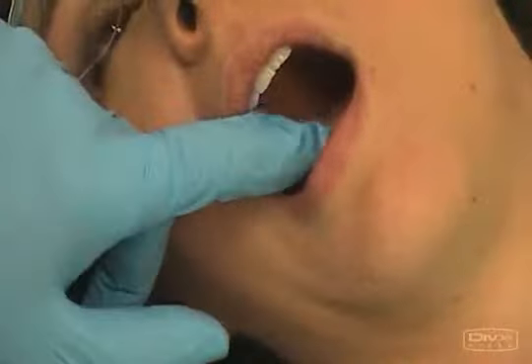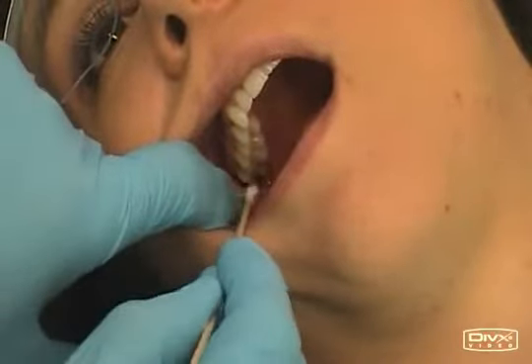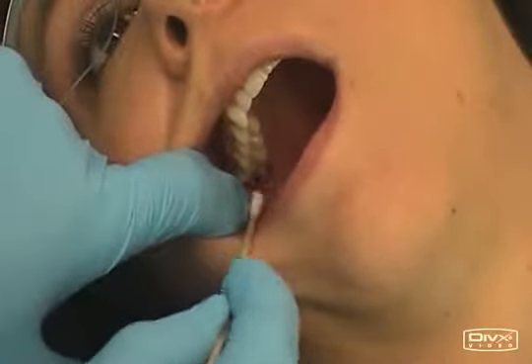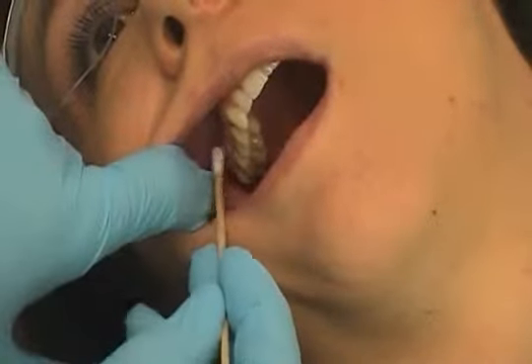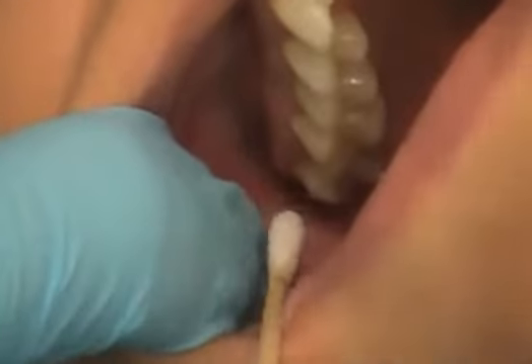Okay, posterior superior alveolar nerve block. The nerves are the posterior superior alveolar and their branches. The areas anesthetized are the pulps of the maxillary first, second, and third molars, the buccal periodontium, and the bone underlying these teeth. The needle gauge and length is the 25 or 27 short.